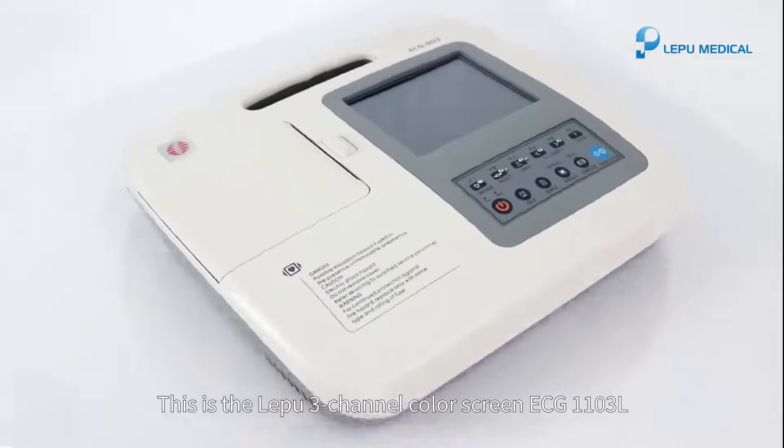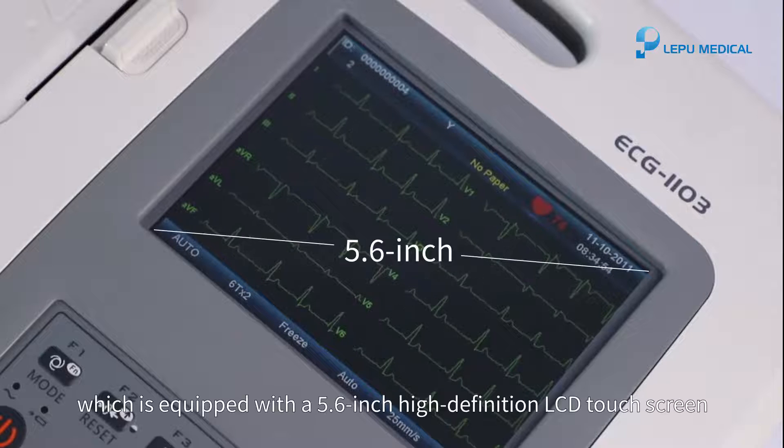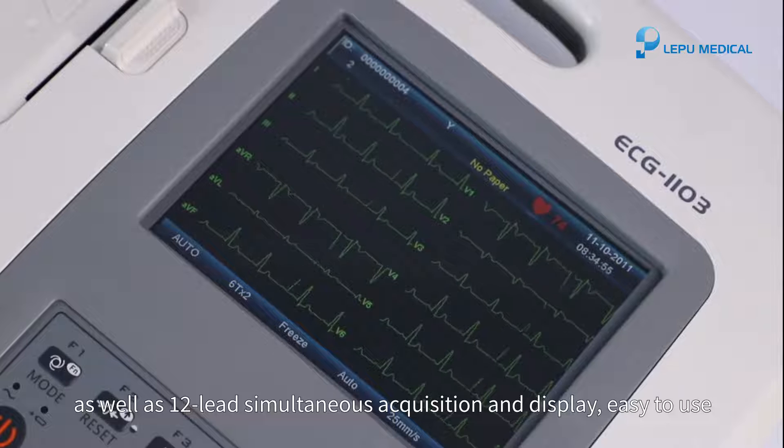This is the LEPU 3-Channel Color Screen ECG-1103L, which is equipped with a 5.6-inch high-definition LCD touchscreen, as well as 12-leads simultaneous acquisition and display, easy to use.